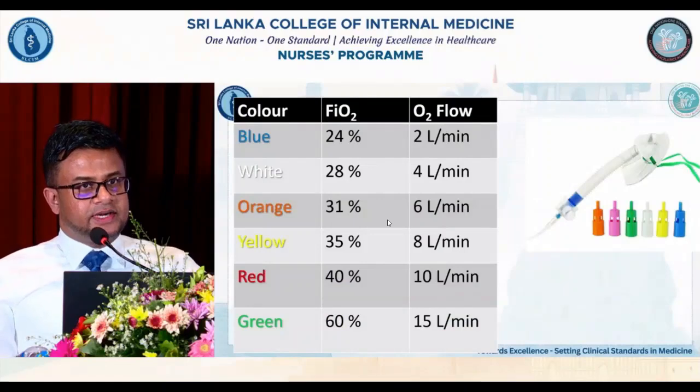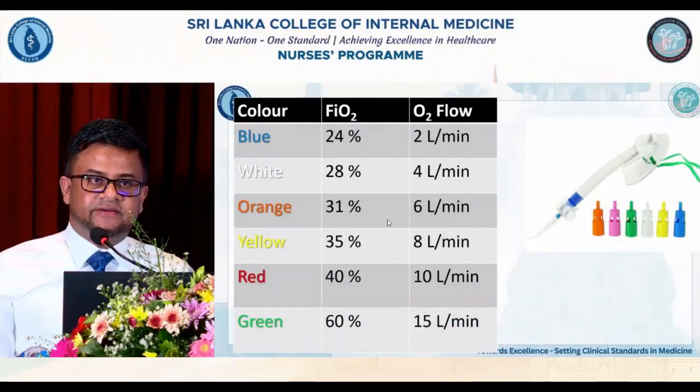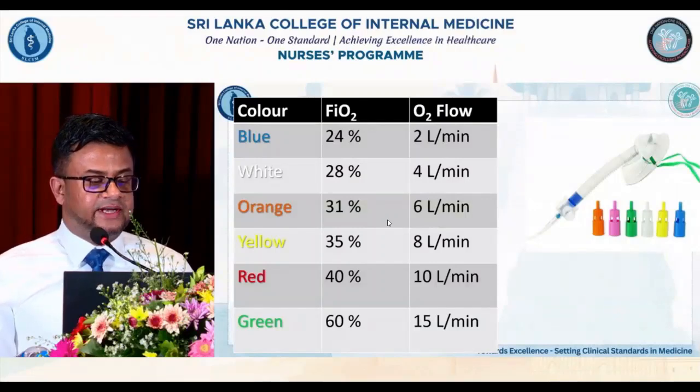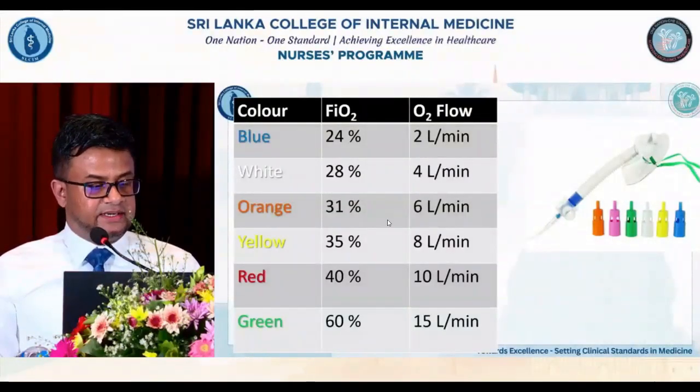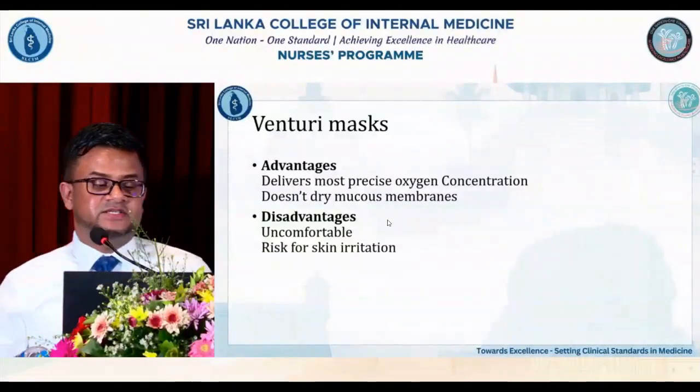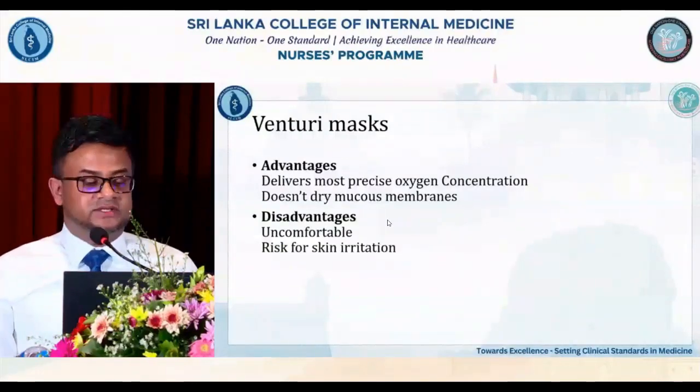So remember the colors. Of course, they will be labeled with the particular percentages as well as the flow rate, separate in each category of Venturi masks. What are the advantages? It delivers the most precise oxygen concentration, as I said, and doesn't dry the mucous membrane.